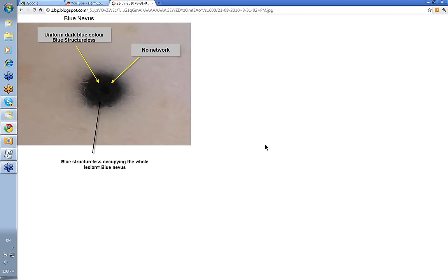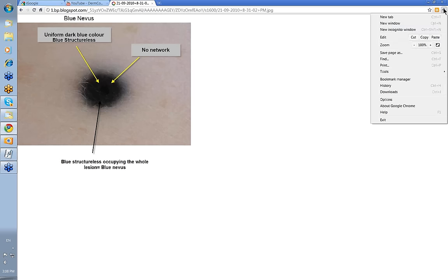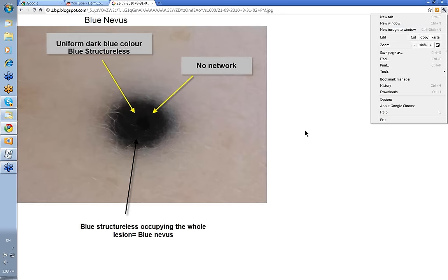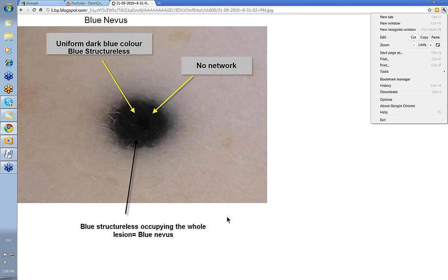This is blue Structureless — it's fairly easy to see this one. Note there is no network there. It's a uniform dark blue color — blue Structureless filling the whole of the lesion with no network. This is a blue nevus.